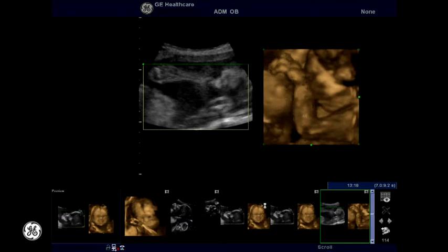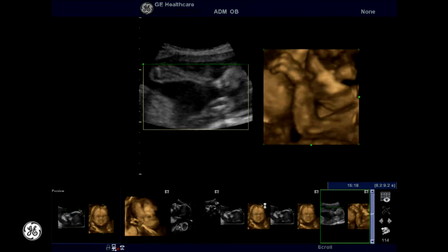fetus is active. This concludes our Logiq F series 3D 4D instructional video.